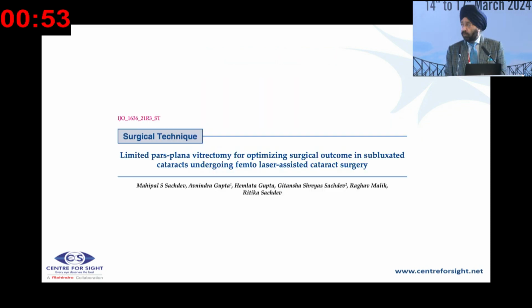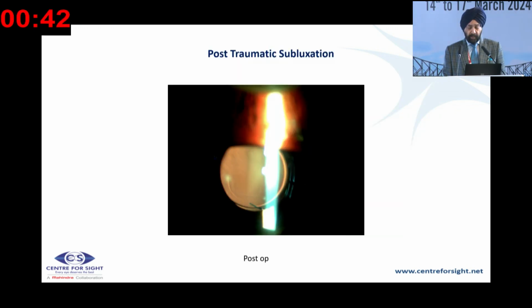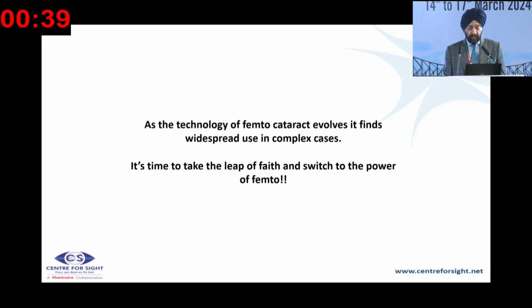This is the post-traumatic subluxation. The important thing, what Dr. Hemlata, I don't know whether you showed this video? She's already shown. So we have already talked about limited pars plana vitrectomy for optimizing surgical outcomes, and we get good results. This is the post-traumatic subluxation.